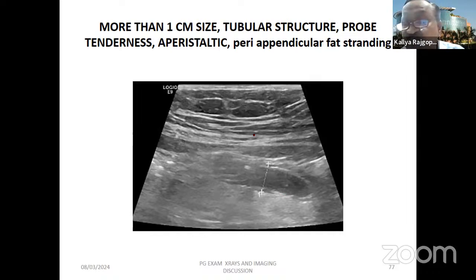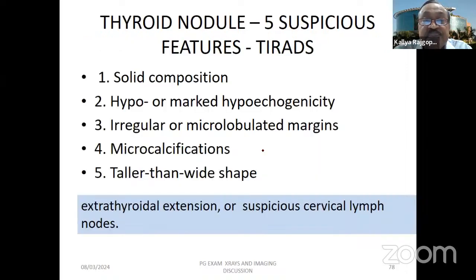So that's what I mentioned to you earlier. If these findings are present, you can almost be sure that it is acute appendicitis. So in other words, ultrasound is one of the important investigations of choice in an acute abdomen. It may not be very specific in mesenteric ischemia and a few other conditions where, of course, CT has the upper hand. However, looking at the advantages and how quickly one can arrive at a diagnosis, ultrasound is the important test.